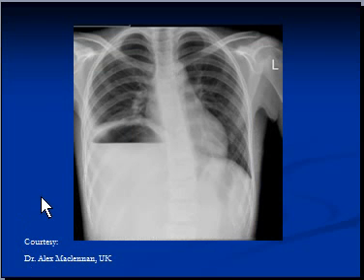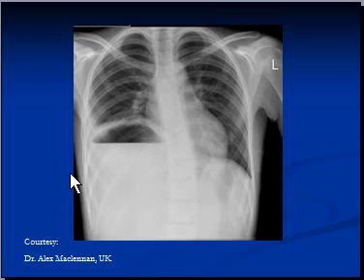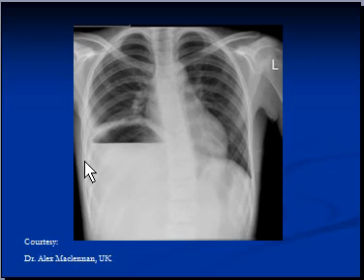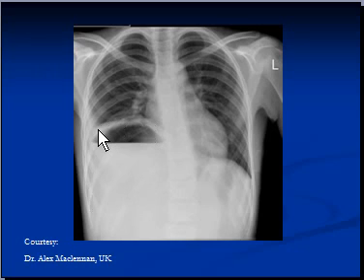Another reason for a raised hemi-diaphragm was subphrenic abscess. This is the x-ray we have seen previously, and we discussed that the diaphragm is clearly visible. There is an air-fluid level under the right hemi-diaphragm, which was a result of a subphrenic abscess. This subphrenic abscess was caused by a ruptured appendix.